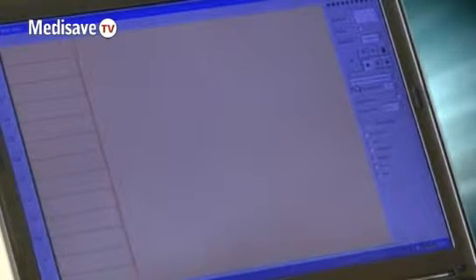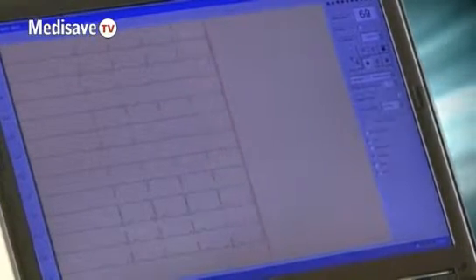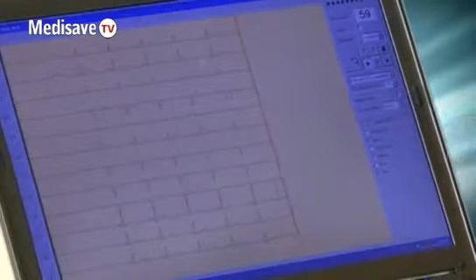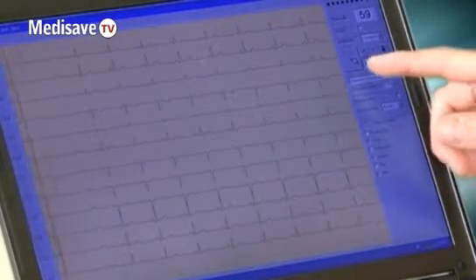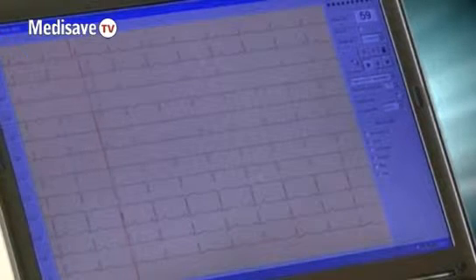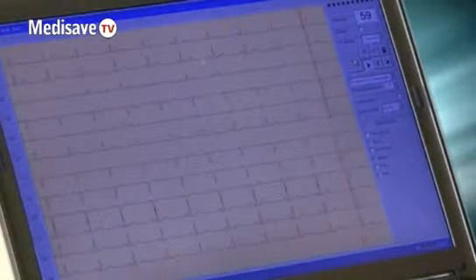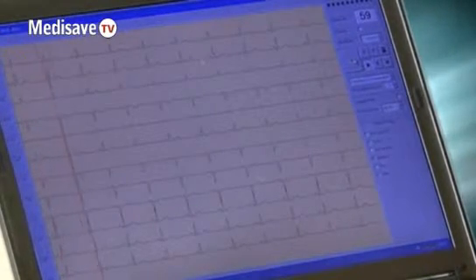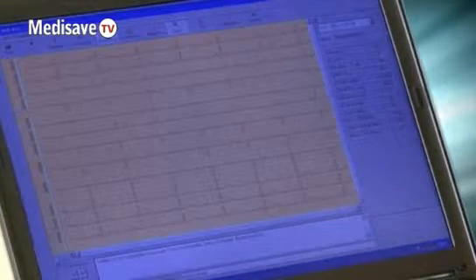The machine is now recording the patient's ECG. As you can see, the trace is running along the screen. Once the red dot in the centre of this square turns red, the unit has enough information to record a 12-lead ECG. Simply press the left mouse key on this square and it freezes the ECG.